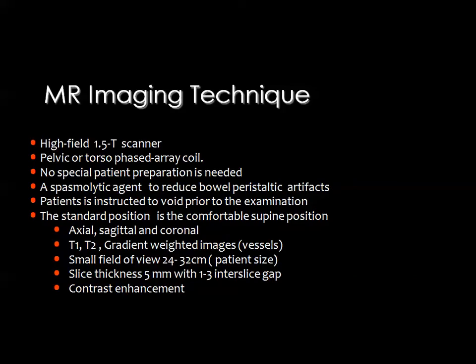The usual examination technique is performed on one of the high field scanners, and we use one of the pelvic or torso phased array coils, and there is no special bowel preparation needed for MRI except that you may inject some spasmolytic agent to reduce bowel peristalsis to avoid some artifacts.